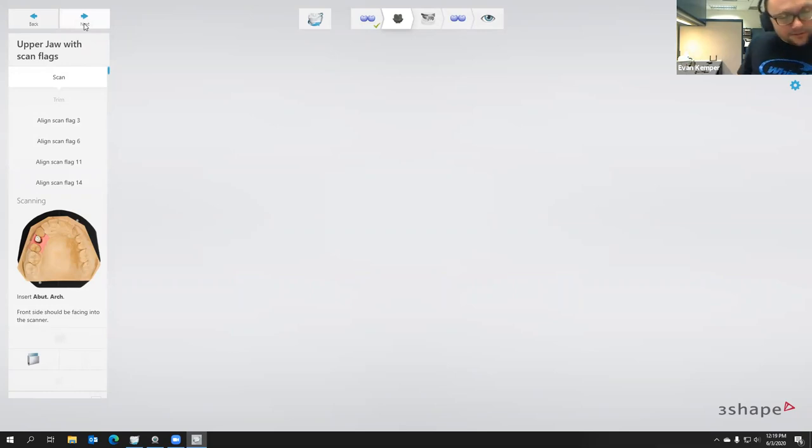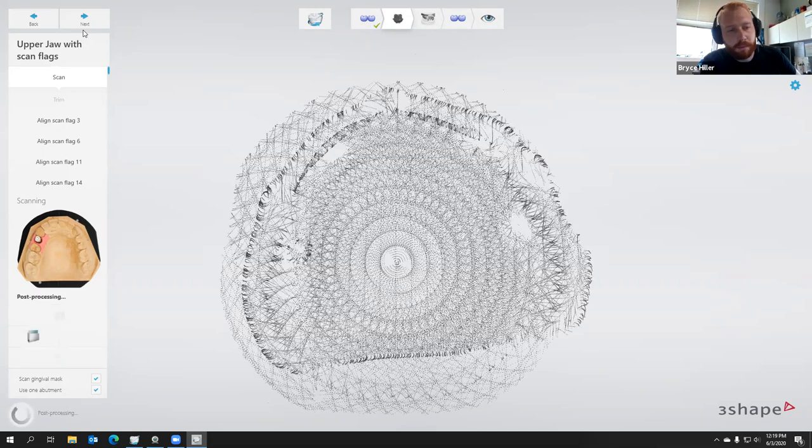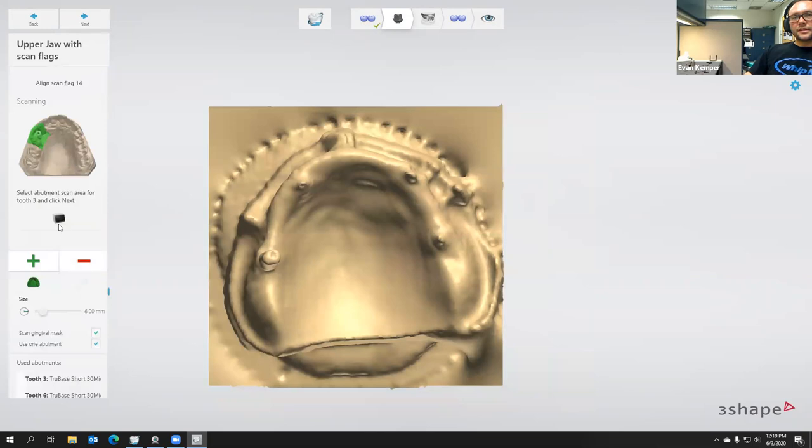I'm just going to go ahead and screw this in. So I've got the first one in. Actually, I'm going to do one thing. I'm going to click rescan here.